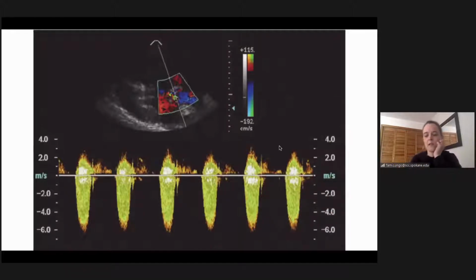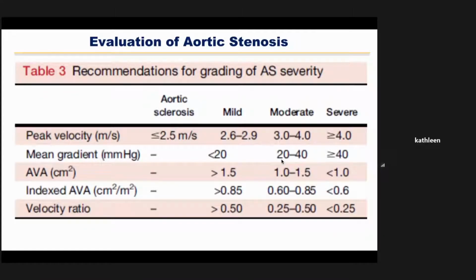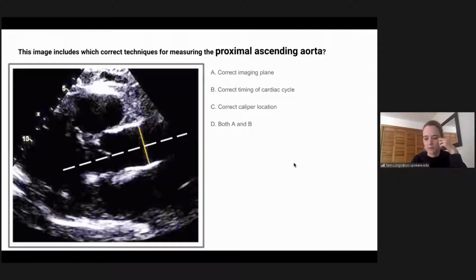Okay, again, this slide, you can just tell by looking at it, which I can't see because your faces are cutting it all off. So I think it's around 6 meters per second, but severe AS. You can adjust where you see us. You can slide the little slide. I did, and then when I do that, it flings my slides. So I'm just going to leave it because it's fine for me. See, I tried to do something and did it again.